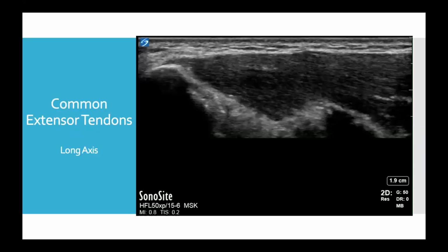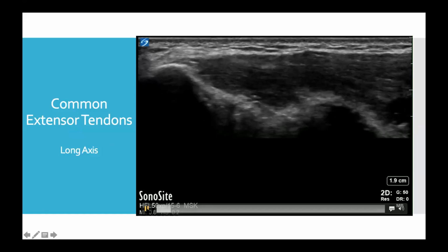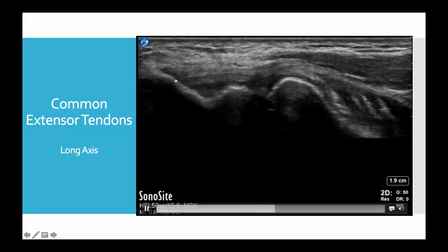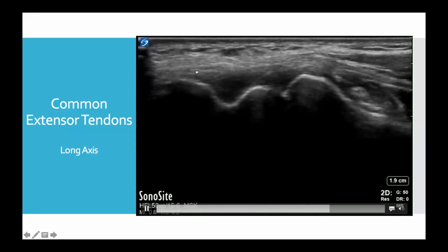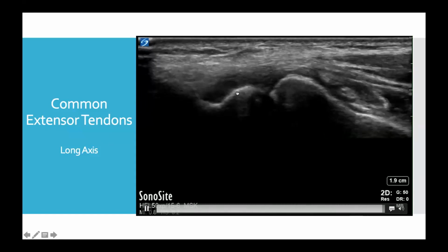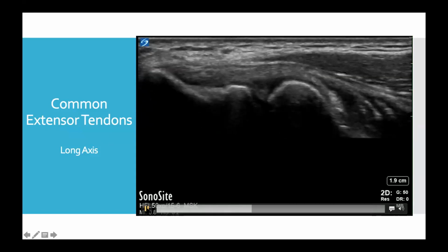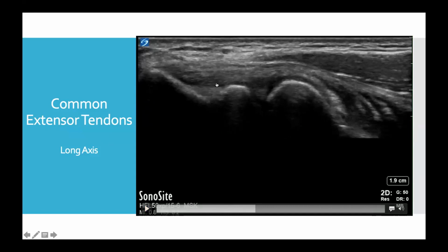And here we can see just that. As we come in, we can see our common extensor tendons inserting up onto the lateral epicondyle. If we pause, when the radial head is in view, we can see our radial collateral ligament, and we can see our annular ligament sitting on top of the radial head here.